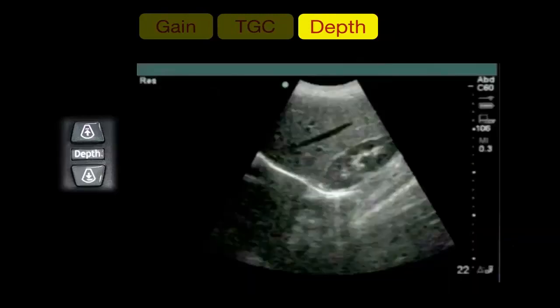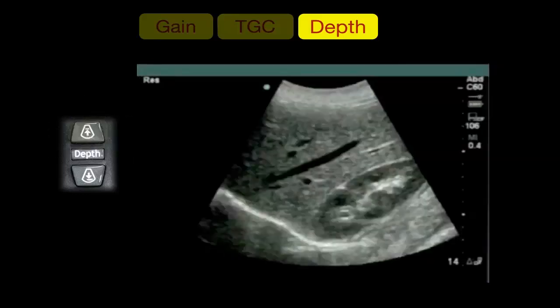The depth button changes the depth of your image. In this image the depth displayed on the side of the screen is 22, meaning 22 centimeters. The proper depth depends on what you are looking for. For example, looking for blood between the liver and kidney in Morrison's pouch, we don't need deeper structures, so we decrease the depth to 14 centimeters. This gives a bigger image for better interpretation and even better resolution, because the machine focuses analysis only on the target organ.